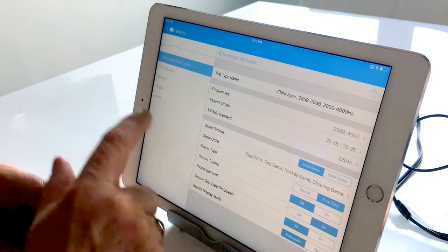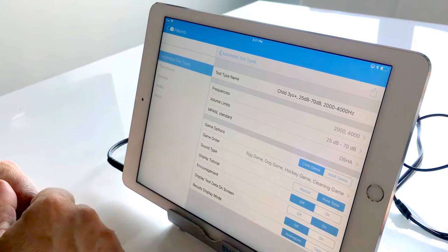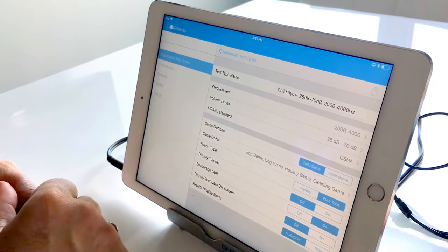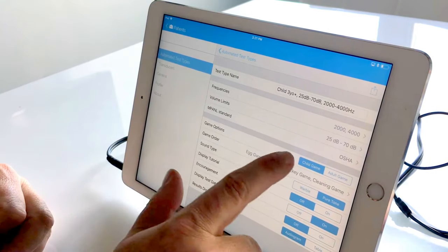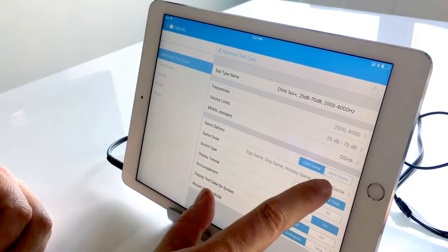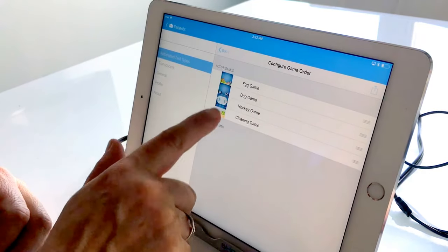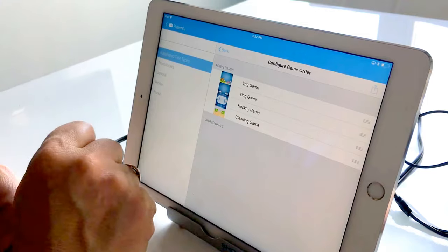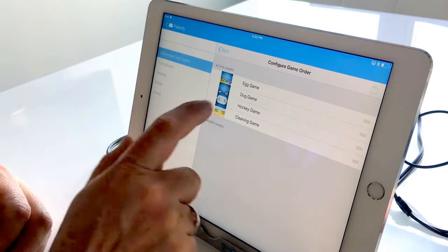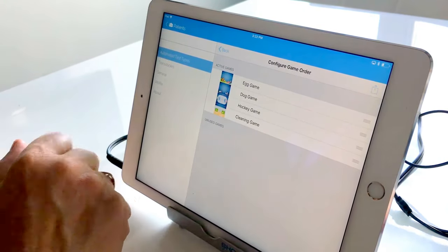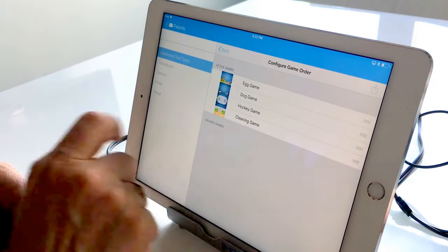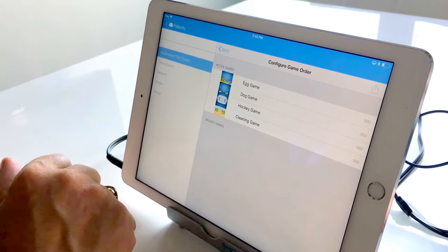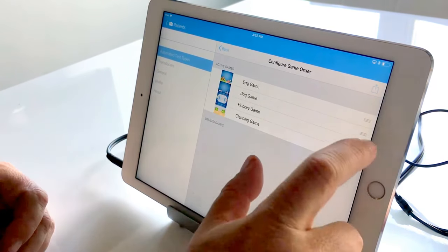In terms of some of these other options, they're really about personal preference. However, because we are dealing with children uniquely I do recommend sticking with the child game. And those child games are further highlighted here. So we have an egg sorting game, a dog sorting game, a hockey game, and a cleaning game. I've actually found that the dog game is the one that's the most intuitive so I always start my pediatric configurations with that one.